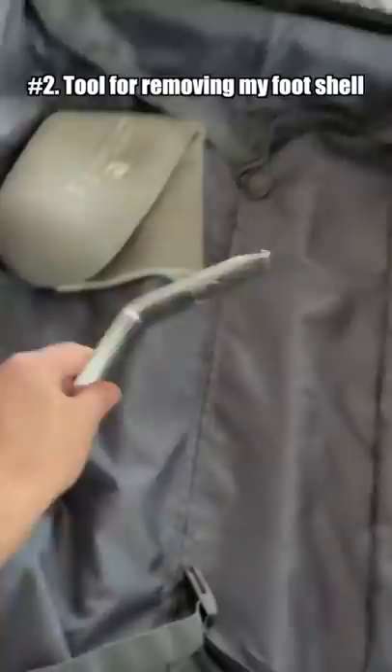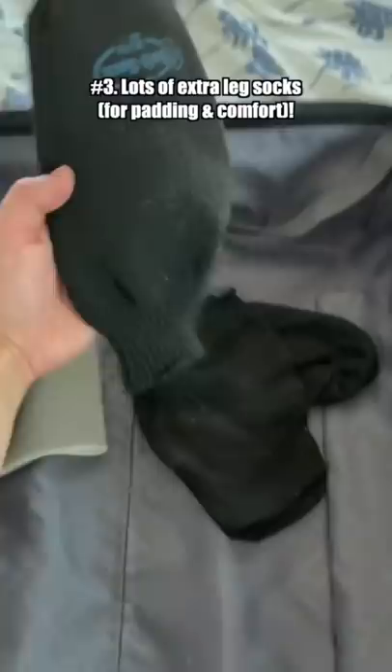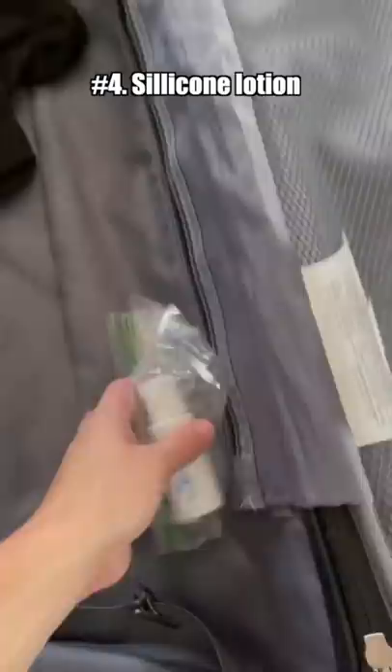Next, we have extra socks. These add layers of padding to make my prosthetic more comfortable. I have my silicone lotion, which is lubricant for my leg, basically. And then, of course, the cleaning solution, which is vital. Hygiene is important.